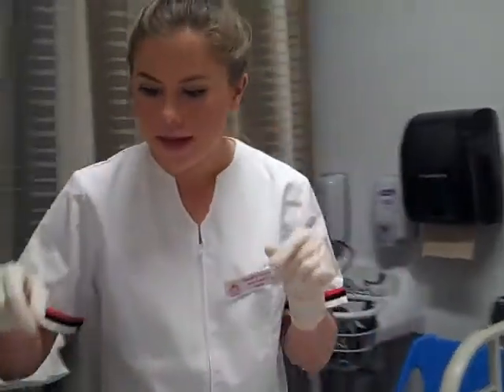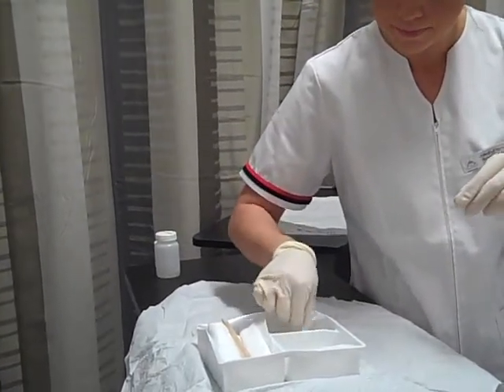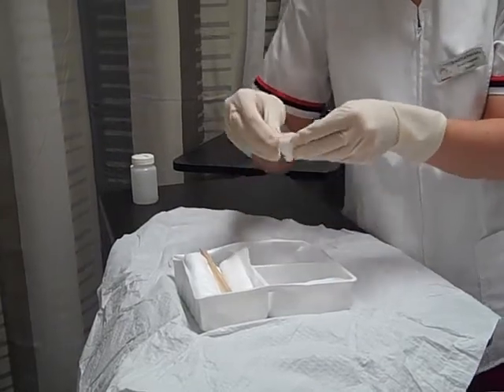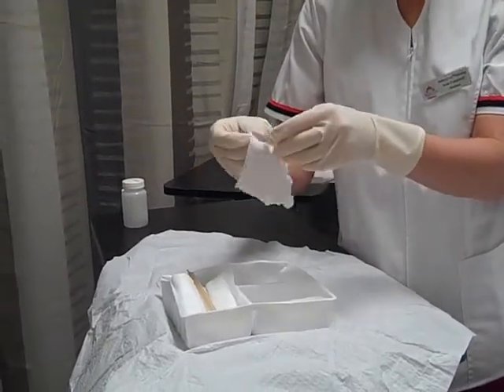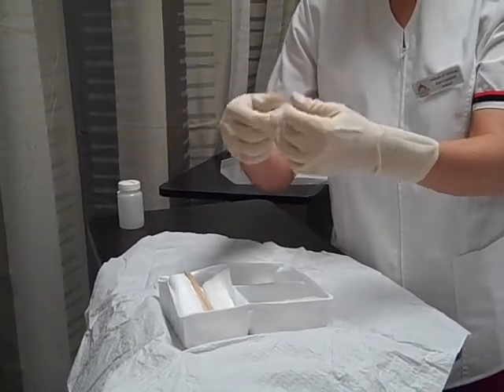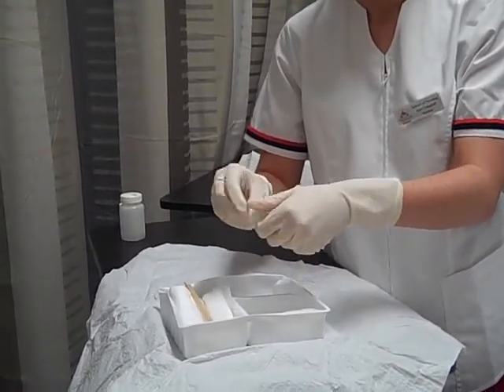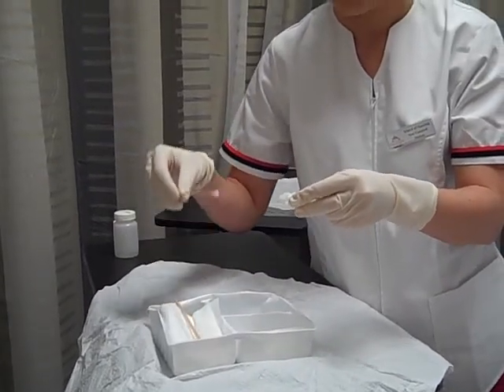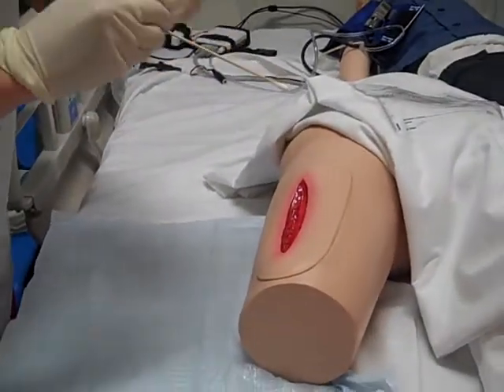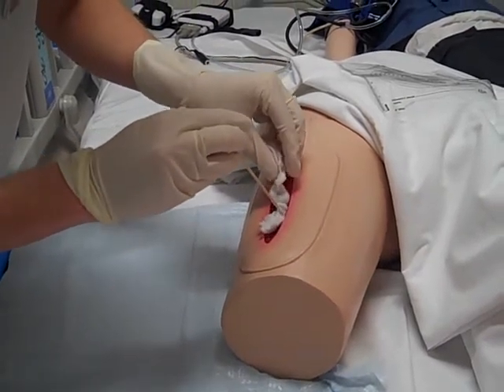Now I'm ready to pack my wound. I will take moistened 4x4 gauze and I will wring out any excess. I then will fluff my gauze and take a Q-tip and I will pack my patient's wound in any tunnels, and I will make sure not to contaminate.